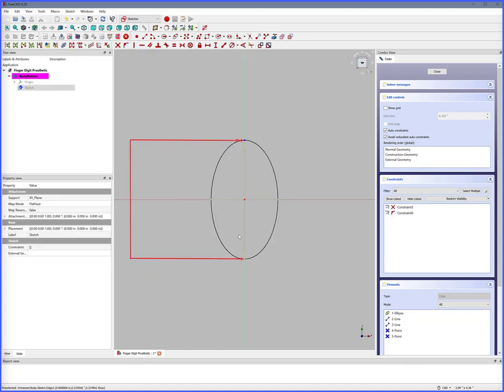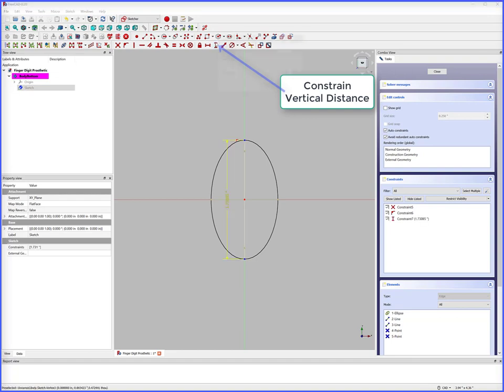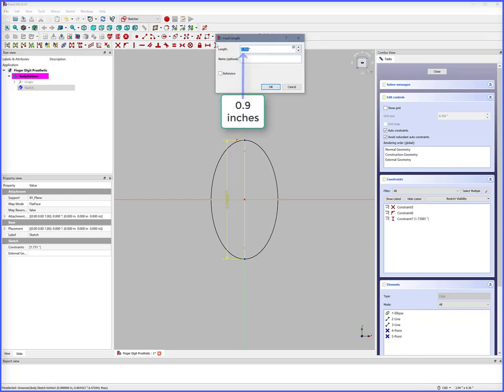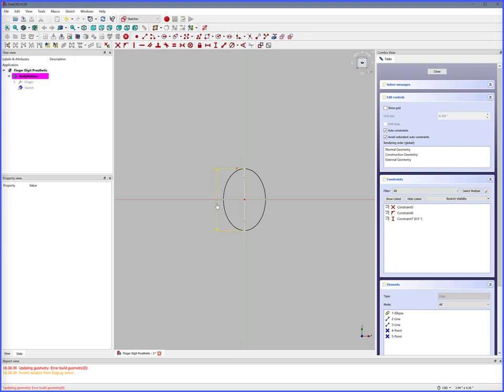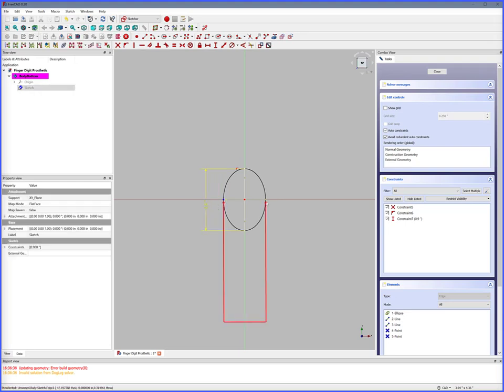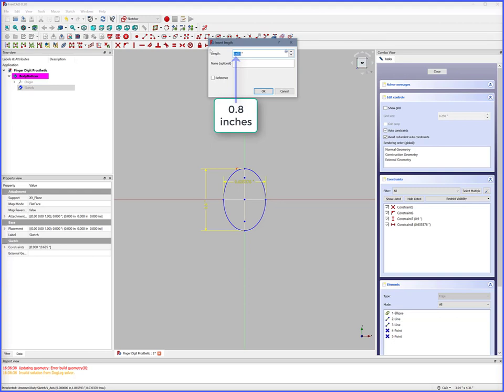Select Y max points, Constrain Vertical Distance — cylinder outside Y diameter is 0.9 inches. Select X max points, Constrain Horizontal Distance — cylinder outside X diameter is 0.8 inches.